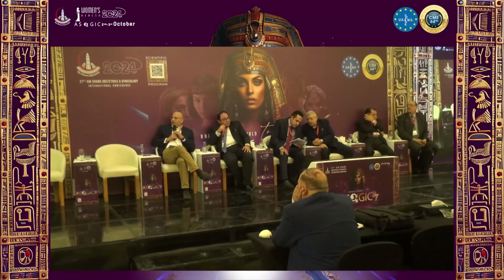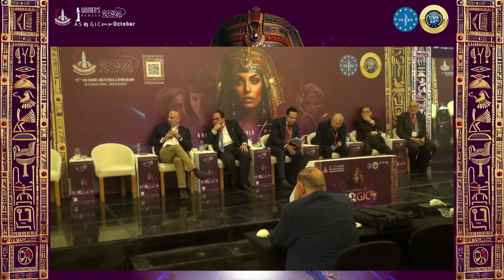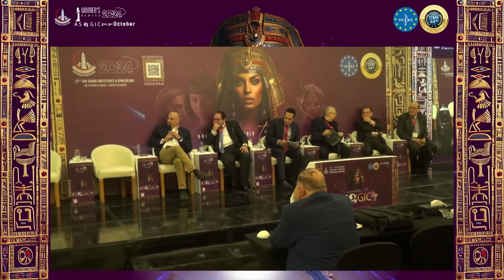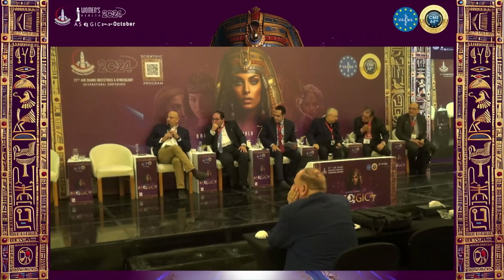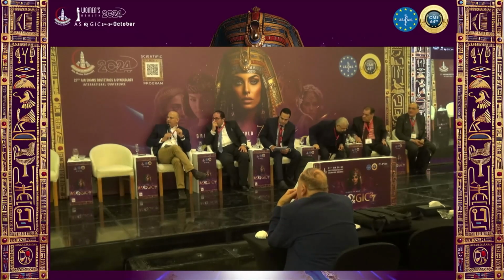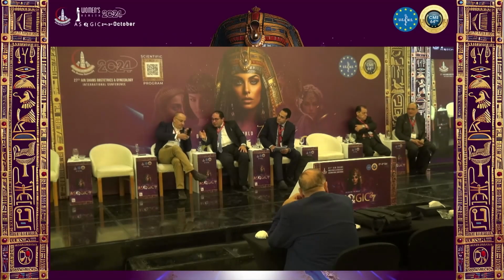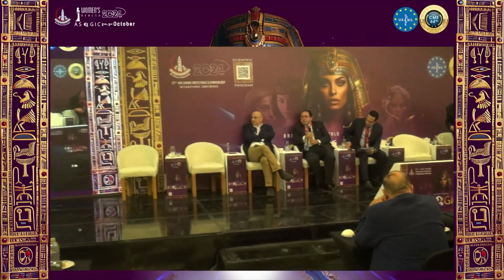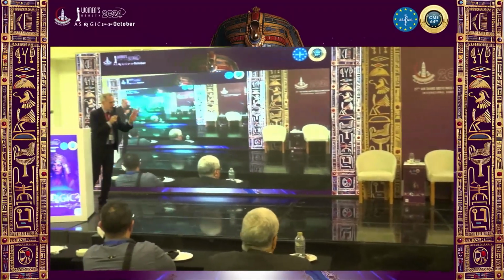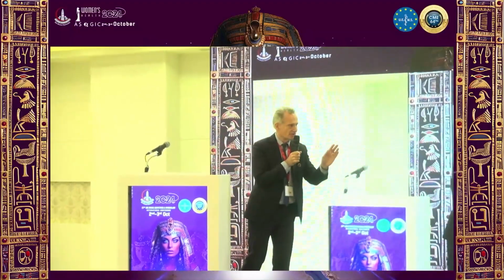I don't know if you are still using what we call the Hopkins 2 lens for microhysteroscopy. It's a lens with a magnifier. Is it still valid, or is it still used for detecting the site of the biopsy? I think we don't use it anymore, the Hopkins one, like before. But still now, you can still go with your hysteroscope against the endometrium and evaluate the superficial vessels and the deeper vessels.